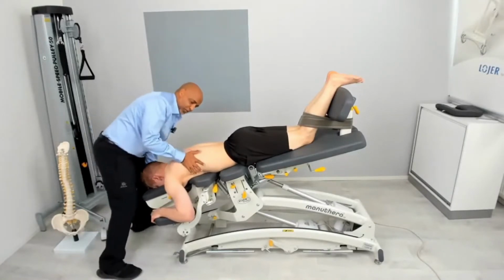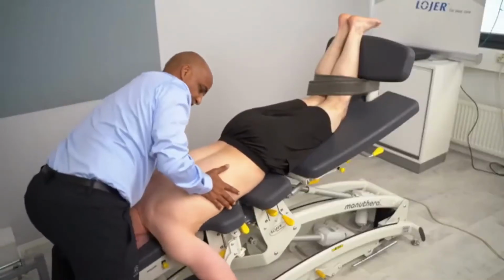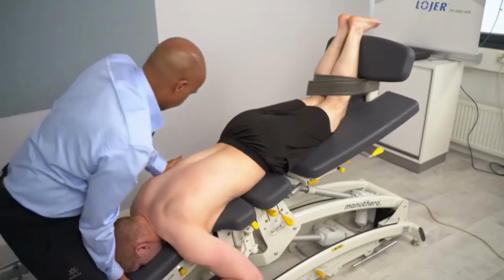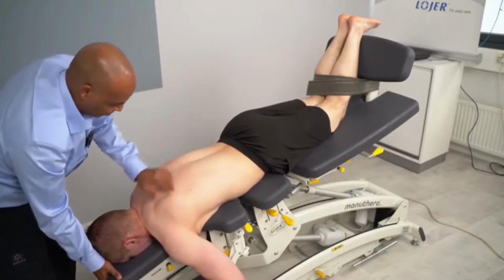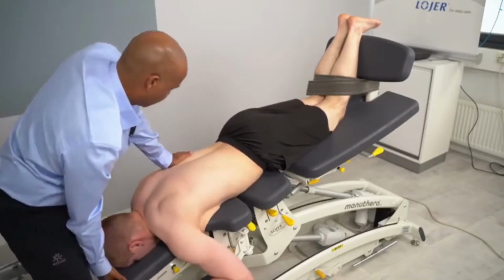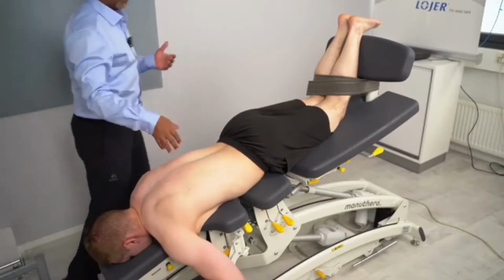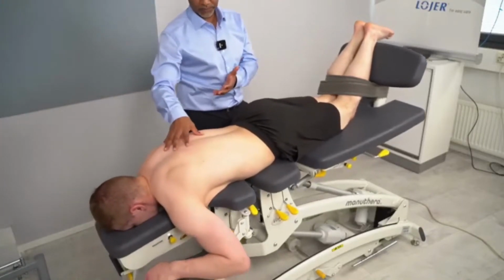The other way I will do it is to stretch the side of the ribs right there. This technique helps a lot when somebody has a very stiff back or breathing issues. Many times you find there are so many muscles, like the rhomboid muscles, major and minor, and the trapezius muscles. How do you get into those deep muscles without causing discomfort? All these techniques can be achieved with Manuthera 242 with the assistance of the angle. It gives you much more benefit, having the right tool to mobilize the spine in this way.